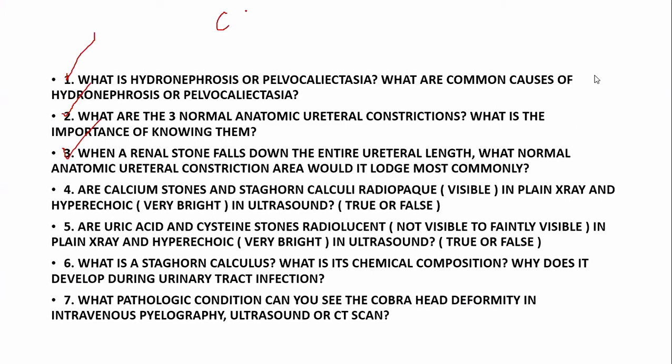So, therefore, calcium stones, di ba, calcium stones, calcium, para ba't calcium? Sabi mo lang calcium. Struvite stone is also radiopaque. Majority, 90% of struvite stones are radiopaque, di ba? So, calcium stones, correct. You can see them actually both in X-ray and in ultrasound.